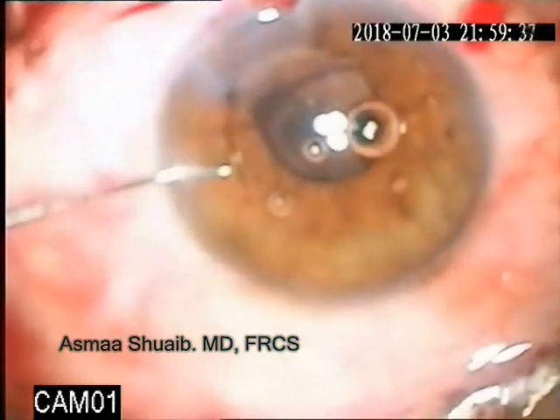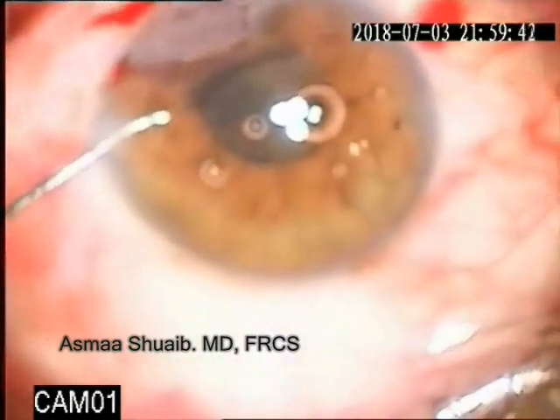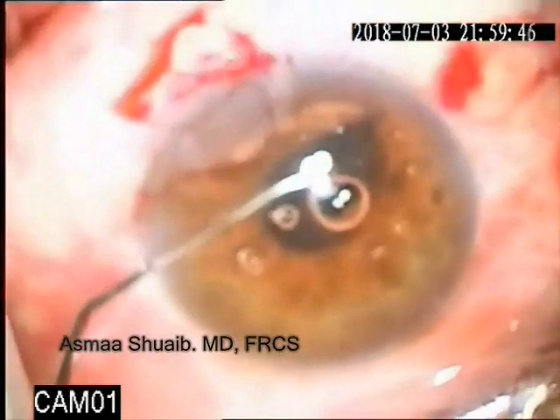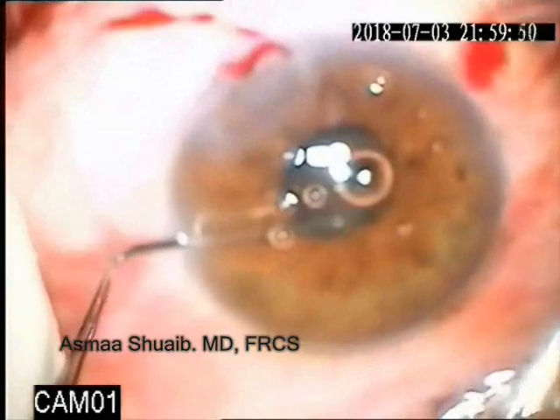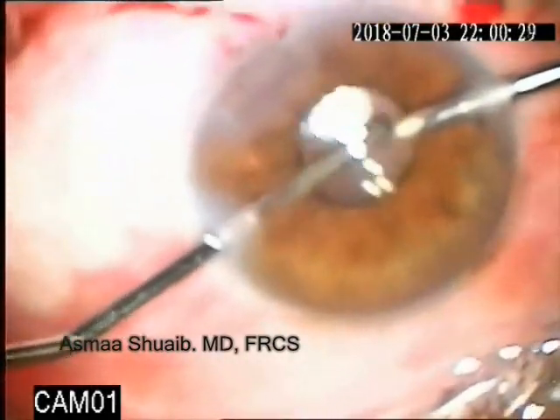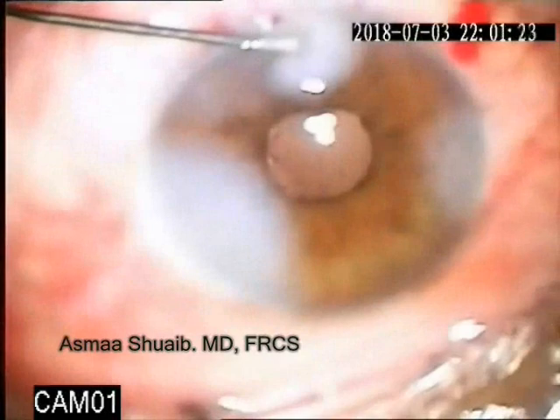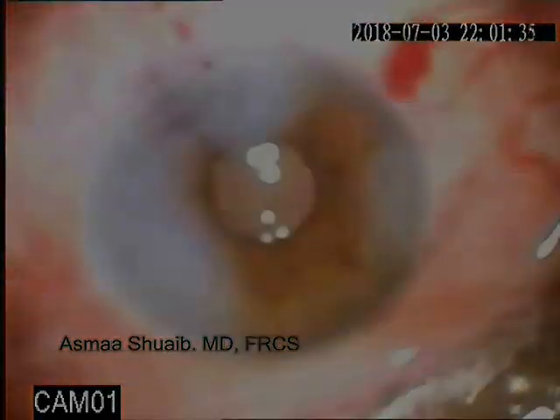So, if you have a case of extended rhexis: first, fill the anterior chamber with a viscoelastic material — preferably a visco-cohesive one. If you can see the edge, you can use ripping forces towards the center of the anterior chamber to complete the rhexis. And if you can't see the edge, make another incision and complete the rhexis in the opposite direction. Thanks for listening.